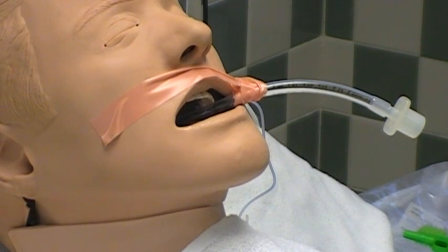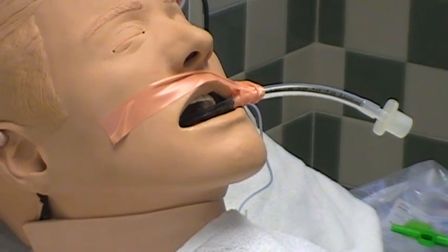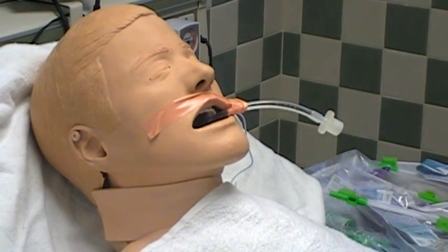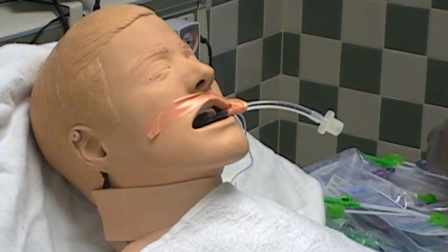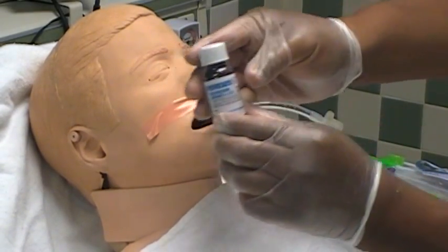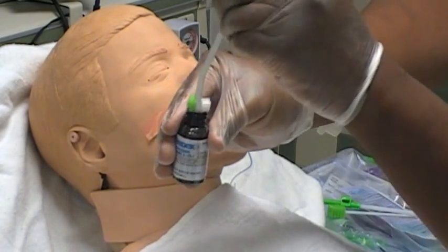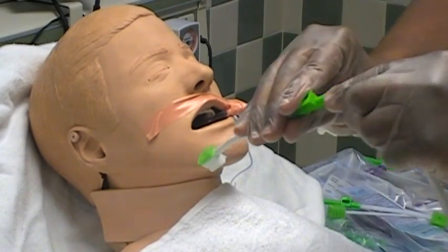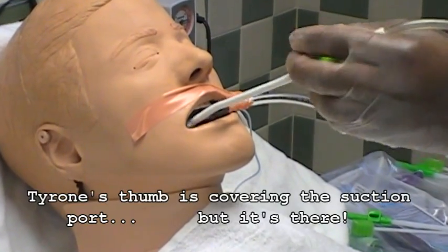Now we're going to roll into teeth brushing. If you're brushing the patient's teeth, follow similar steps. We're going to use the skinny suction tubing in the kit and suction the patient's mouth. Tyrone is also going to open the chlorhexidine bottle and dip the toothbrush into it. Then he's going to attach the end of the toothbrush to the suction tubing and gently brush their teeth. He can apply suction pressure as he needs to with his thumb, just like he did before with the oral care.